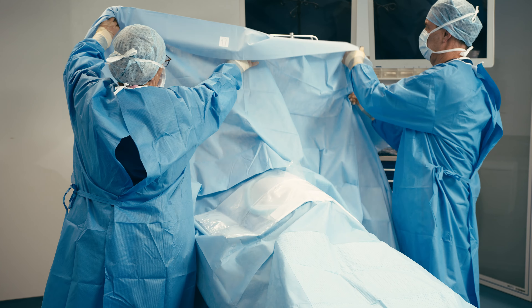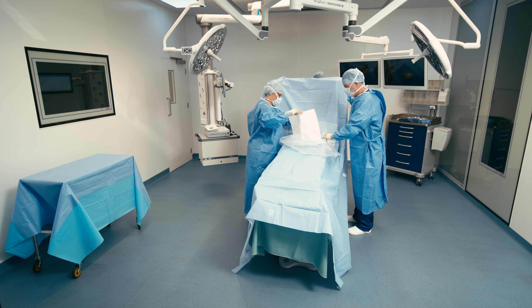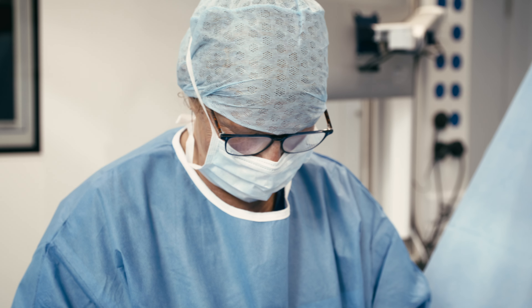At this point, the drape is large enough to provide an anaesthetic screen and can be secured by floor staff. Unfold the pouch and remove the protective lining, ensuring that the incise film is fully and smoothly adhered to the patient's skin.